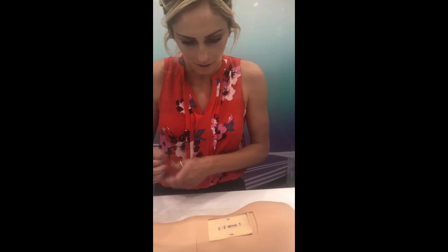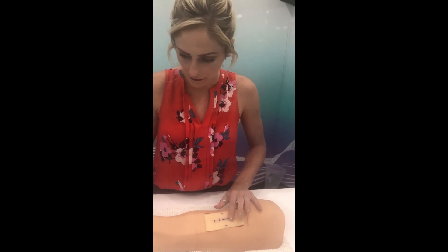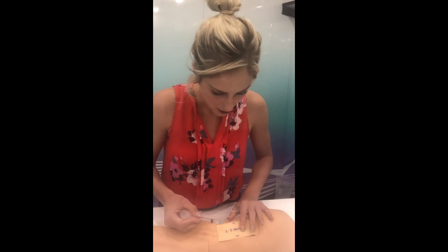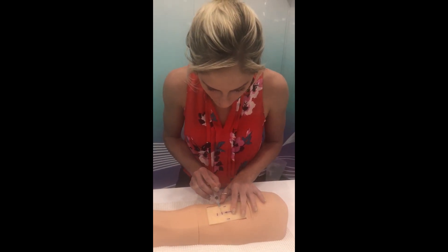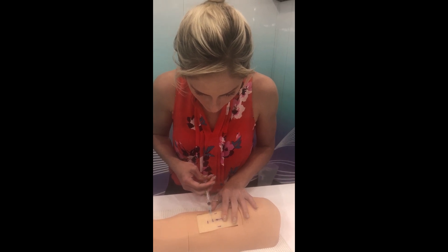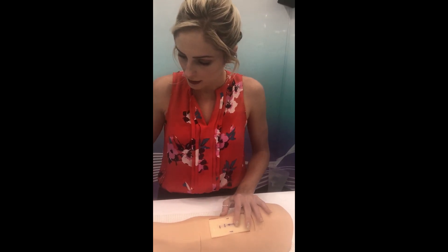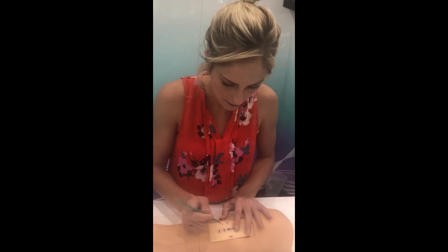What you're going to do is place your non-dominant hand — just stabilize it, don't press. Everything's going to be done with one hand, even the lidocaine. Half a cc in the incision line, full sideways. You don't want to break the concentration. She's doing great. Check for anesthesia. She was practicing. And then we're going to make sure it's numb.